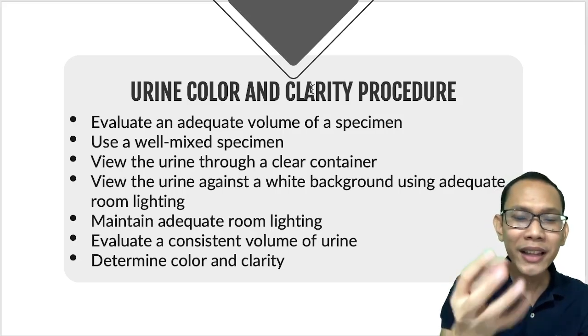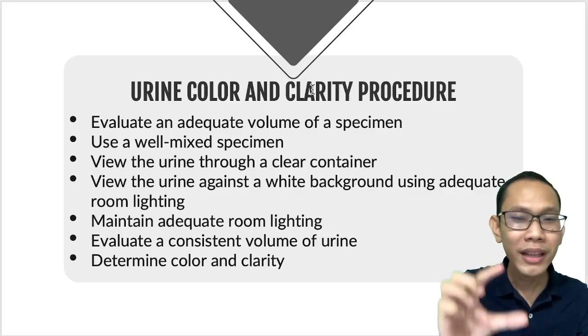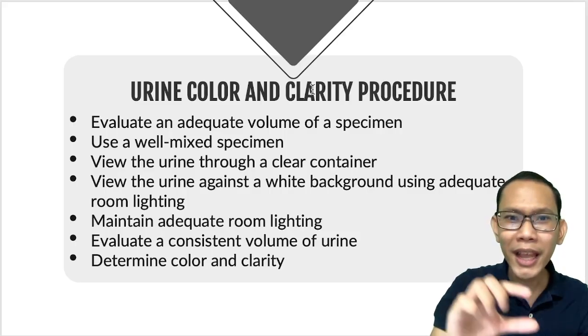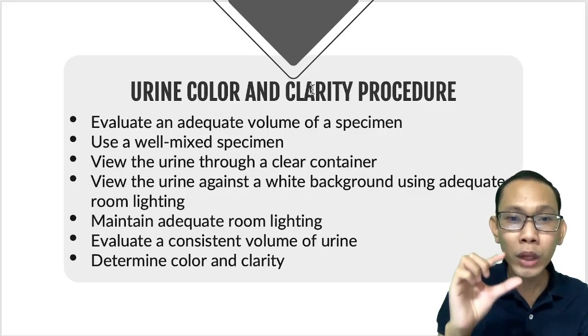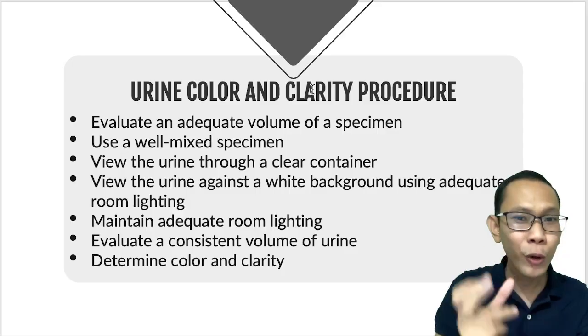So, ano nangyayari? Nagsisettle down yung sediments, and what will happen? Ang nakikita mo, if you are not going to mix your sample, nagiging clear siya. Nagsisettle down yung ating mga sediments sa bottom because of gravity, and it will look now as clear. So, it will create a falsely negative result. That's why you have to thoroughly mix your sample.